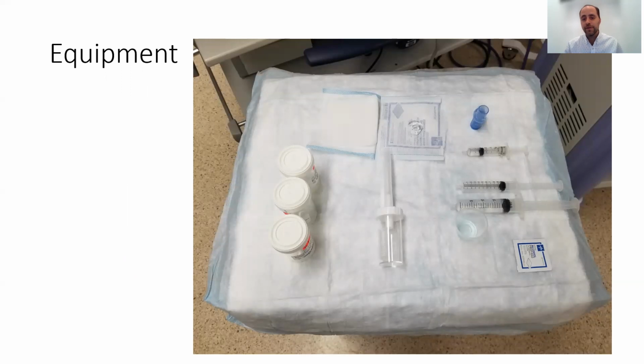This is what my table in the OR typically looks like. Here are my sterile collection cups, my gauze, lubricant, my swivel adapter, some lidocaine, some saline, my sterile collection cup. You'll notice that I don't have epinephrine here. I don't have pulmozyme. Those are oftentimes used only as indicated for certain types of procedures.